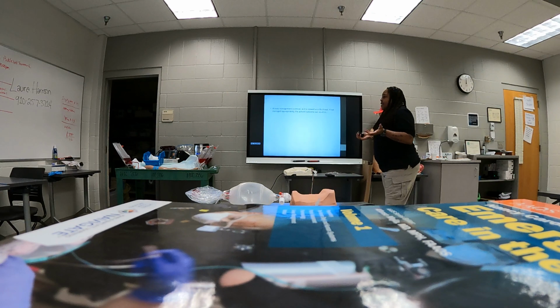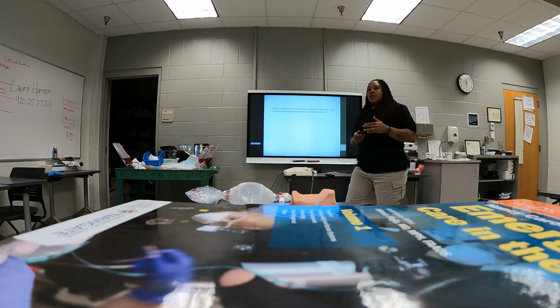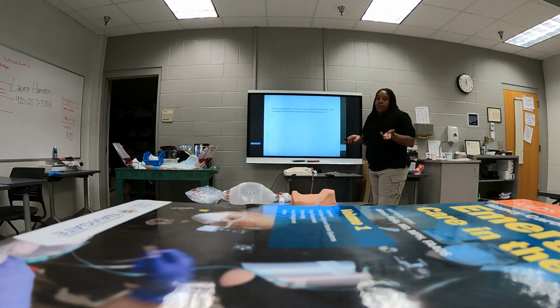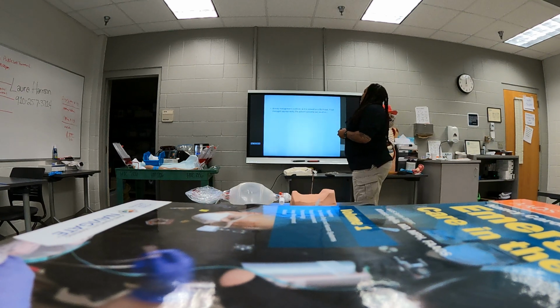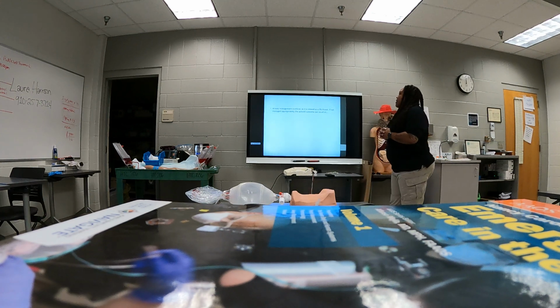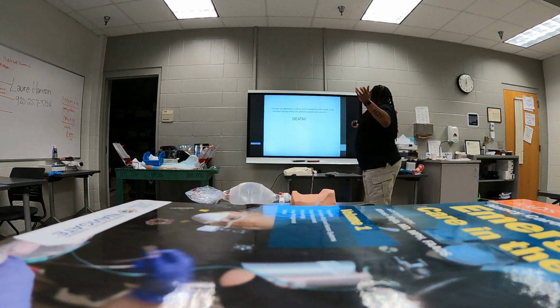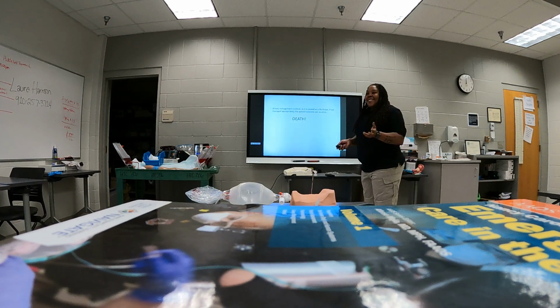Yes, ma'am. Okay. Why is cricothyrotomy important in the pre-hospital setting? Well, for us in the field, and you'll get to see this when you go on some of your clinical rides and even when you get into your services, it's for airway management that is critical, as it is viewed as a life threat. If not managed appropriately, the patient outcome can result in, what do you think? Death. It's death. Look at me go.